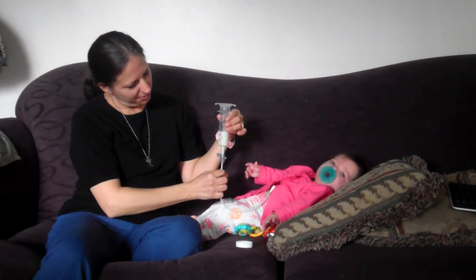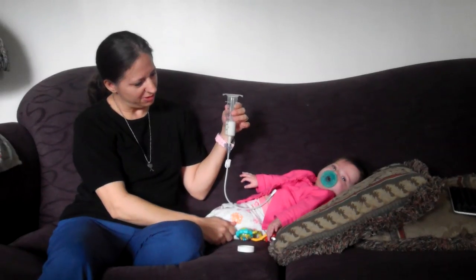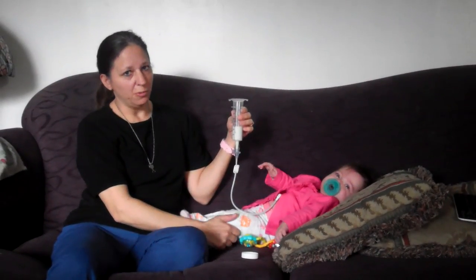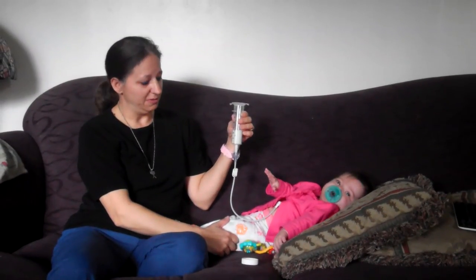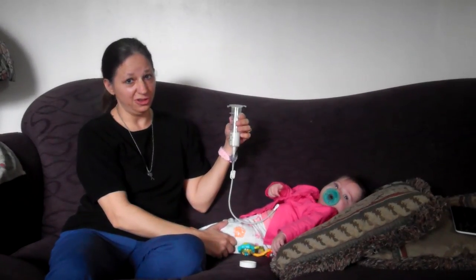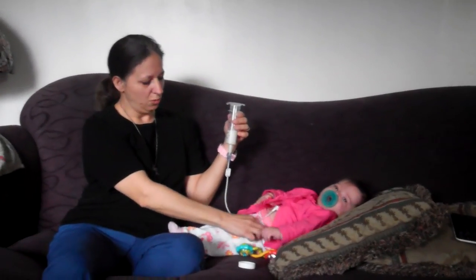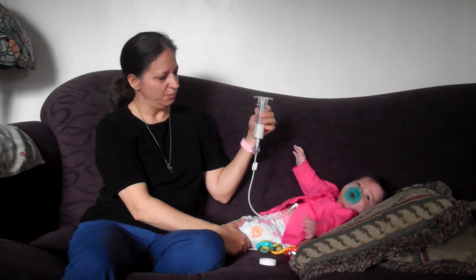Or I can clamp it again just to give her body some time to adapt to the food being poured in your belly. And you're going to find what works for you. I'm not a medical professional whatsoever. I'm not giving advice to anyone, telling them what to do. I'm just sharing our own personal experience because we didn't have anything to go by when we found out that Hannah was going to be on the G-tube.